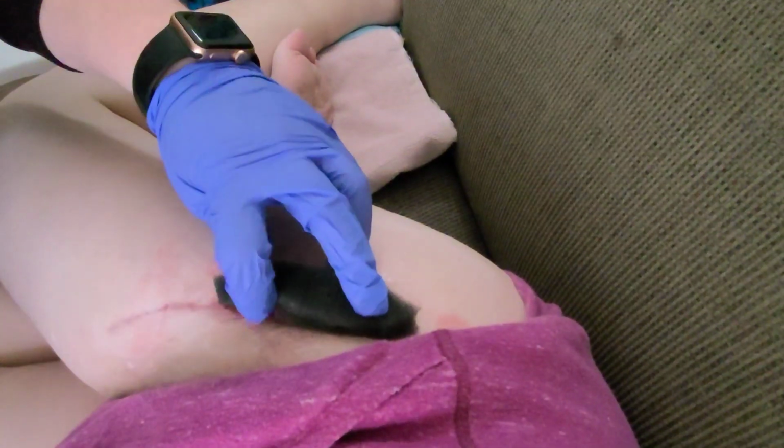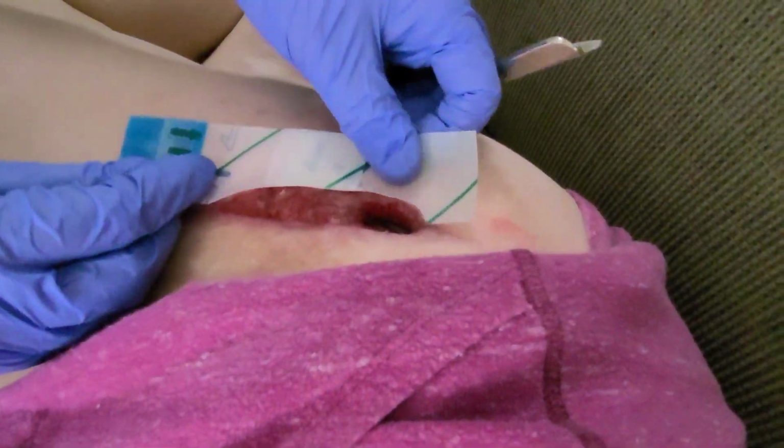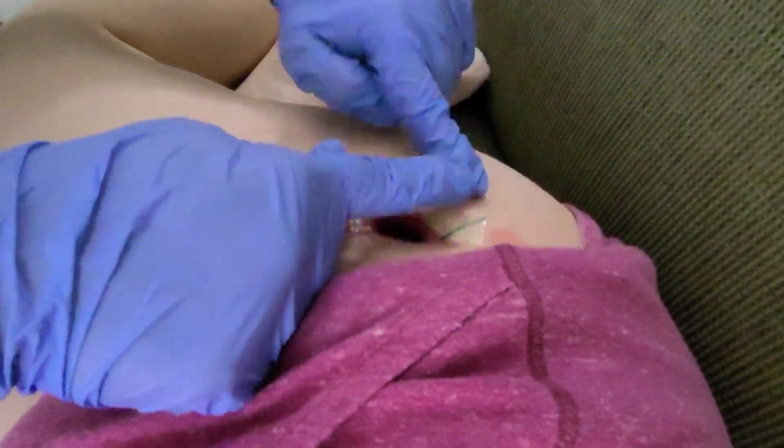So she is now starting to measure the foam. And of course, this is a lot of trial and error. Cut a little bit, put it back, cut a little bit more, all the way until she gets it just right. She always jokes that it's a good thing she's a little crafty because she can really get it to fit just right because she likes her crafts and all that good stuff. She then brings the tape over and starts to measure where she wants to cut because she has to lay down a layer of tape on my skin underneath of the foam, and that just protects my healthy skin from the foam doing any damage.